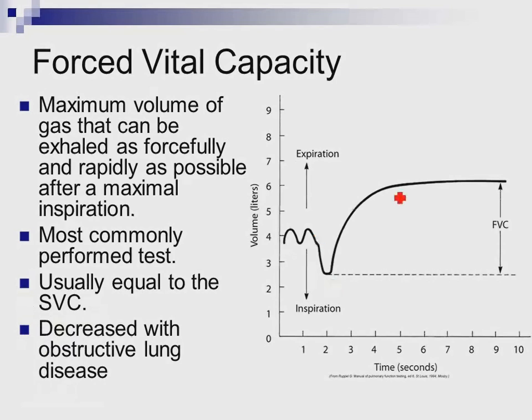Now, if I didn't make mention of this last time, one of the things that a pulmonary function technician gets to do is yell and scream at the patient because you want a maximal effort. Literally, you're screaming at them to get that done. Has anybody ever had a PFT done? Yeah, they do that. You want the best possible effort you can get in the process, okay?